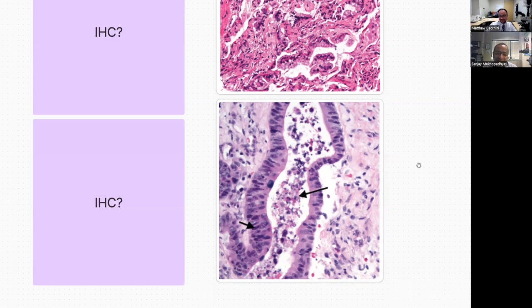It's a Friday, and I want to sleep at night, so then I'll do a TTF1 and CDX2, yeah. And it invariably is CDX2 positive, TTF negative, and I think that it's not at all wrong to do that. If you want to confirm, I think this is the setting to do it in. Yeah, so both approaches are fine.